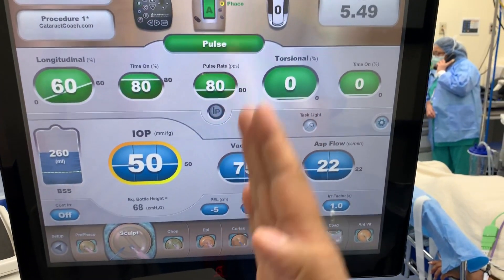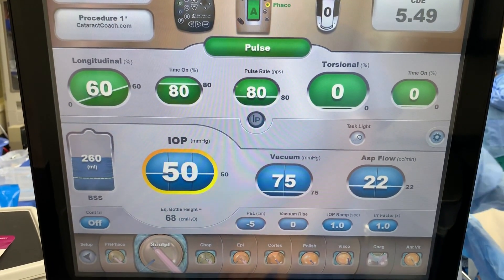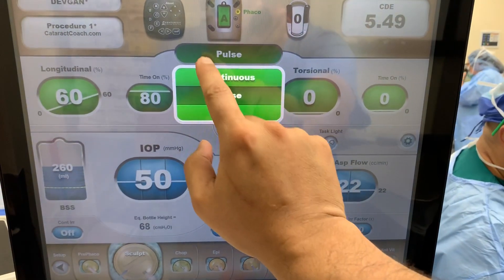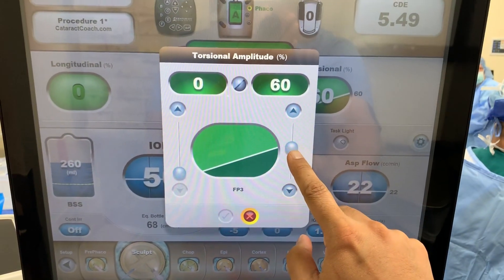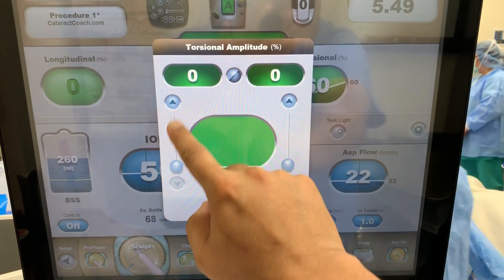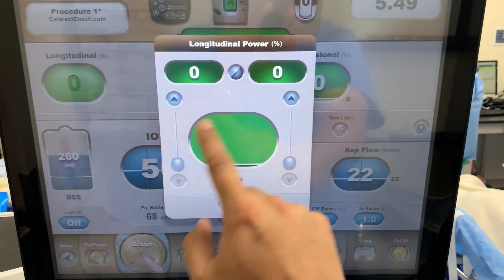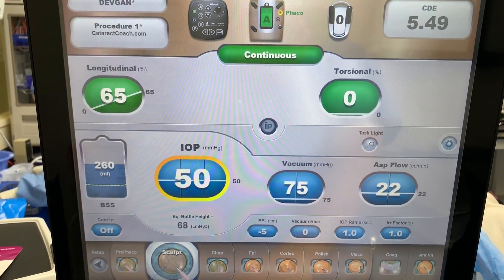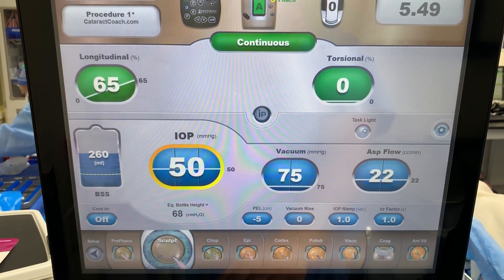For the sculpt mode, we want to groove these channels — sculpt these channels in the nucleus for a divide and conquer or stop and chop. Look at the options. We can do continuous. If you're going to do continuous, I think you'll be better off using more longitudinal. So let's not do torsional, let's do longitudinal. That's continuous, where the foot pedal will control the energy.